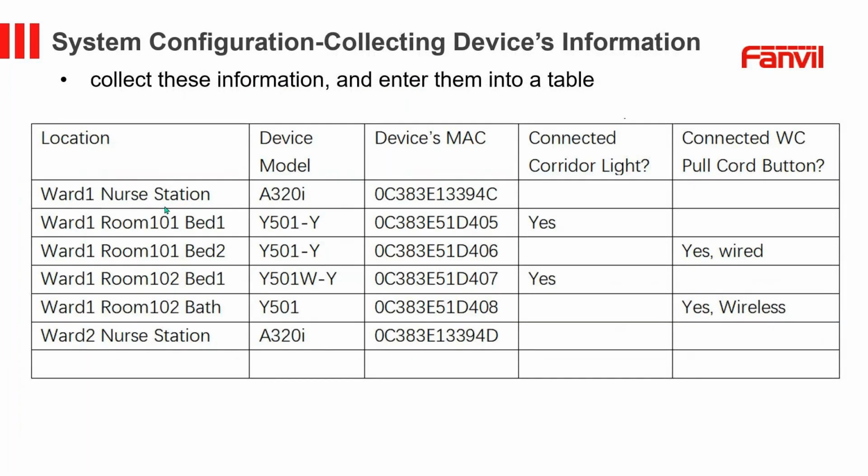And before adding the devices, ensure that you collect all the necessary information for each device, such as MAC addresses and device names. You can enter these details into a table for easy reference during the configuration process, as shown on this table.